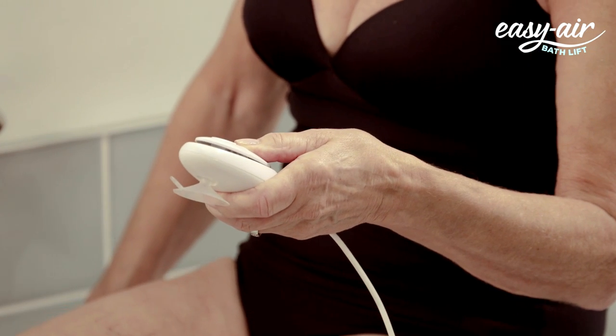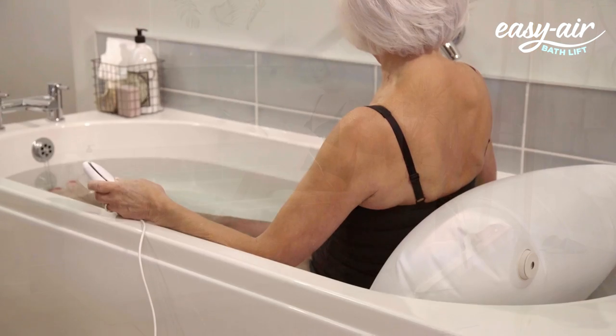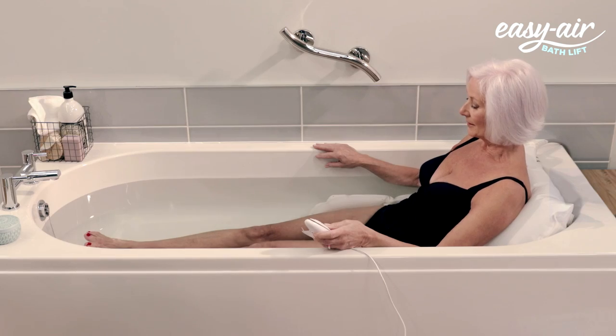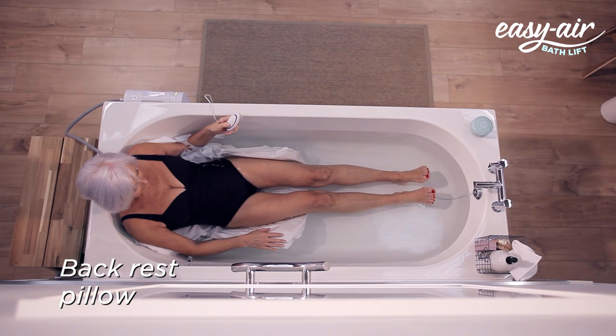Once in a stable position, use the waterproof handset to deflate the Easy Air Bath Lift. The Easy Air Bath Lift will not lower you into the bath unless there is sufficient charge in the compressor to get you back out. Fully deflate or keep some air in the backrest pillow.